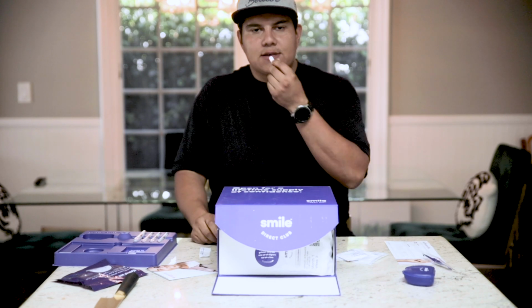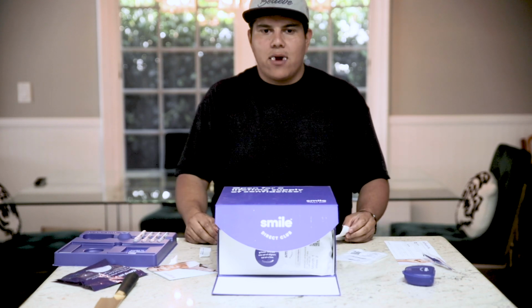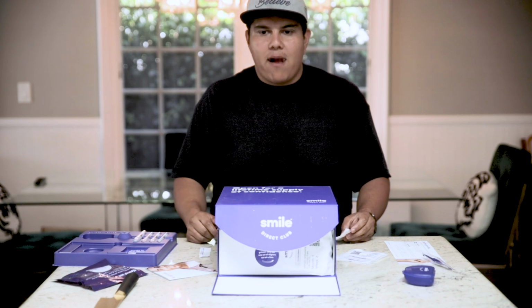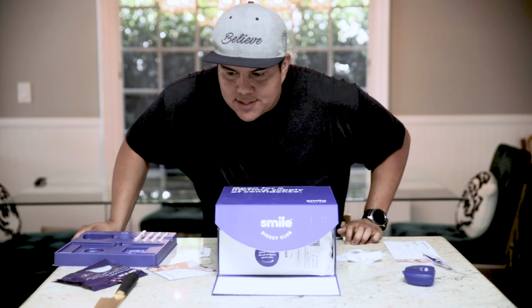You do the chewies to kind of tighten everything else out, because now it feels even tighter, because you're really pushing them in. And make sure I don't swallow these things. But yeah, now I have them in. Let me get closer to you guys. I don't know if you guys can even tell. I mean, that's the whole thing, right? You're not even supposed to tell that you have these things on.